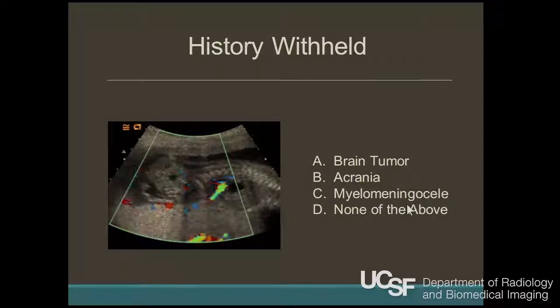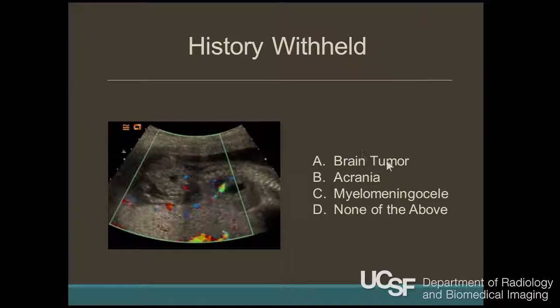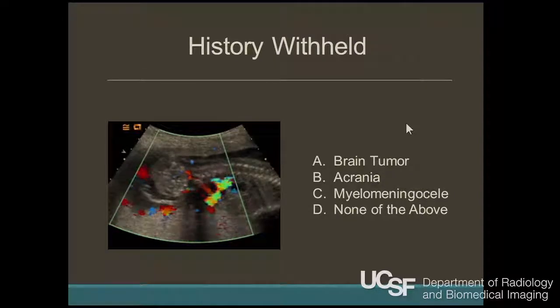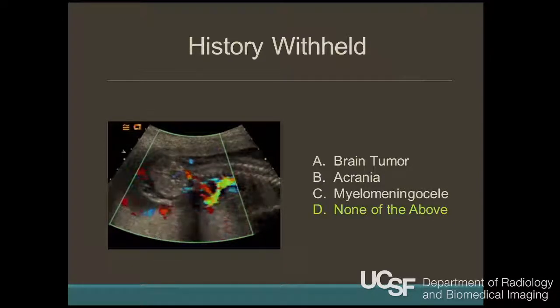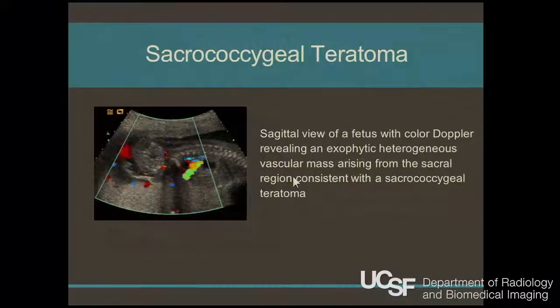So this is a cine clip. I will tell you it's an OB ultrasound if you didn't catch that. Just try and figure out what you think it might be. And this is none of the above. So this is actually a sacrococcygeal teratoma.